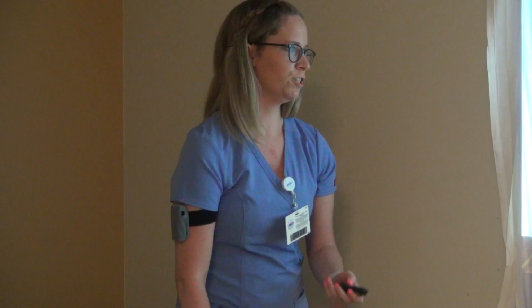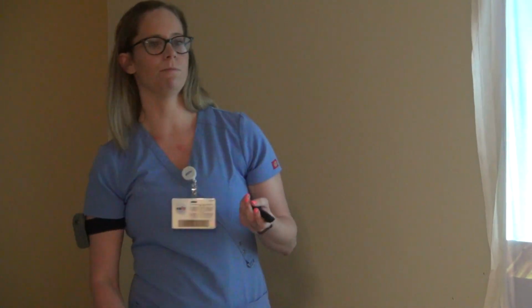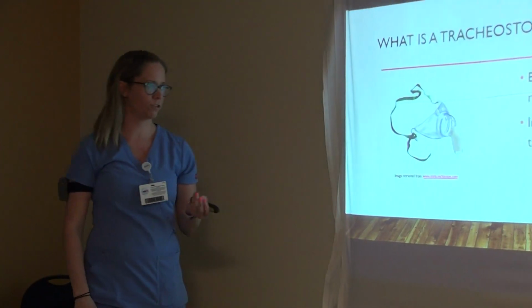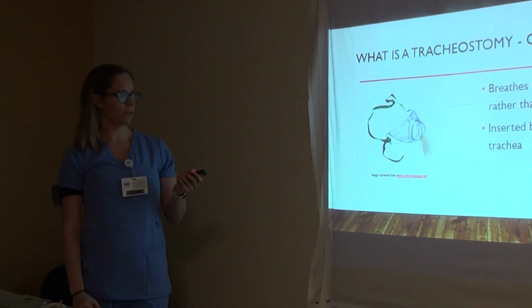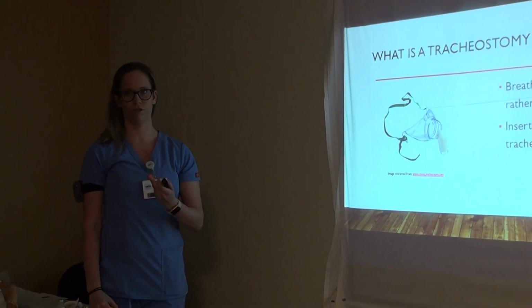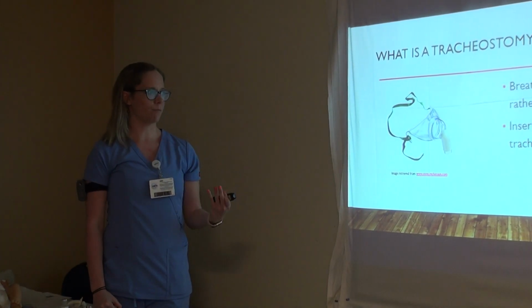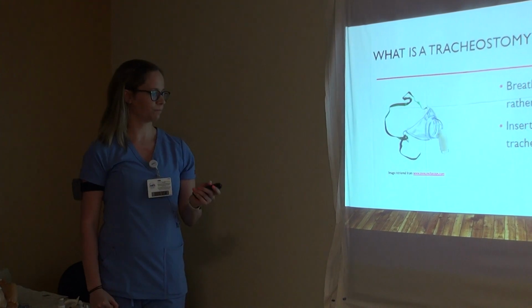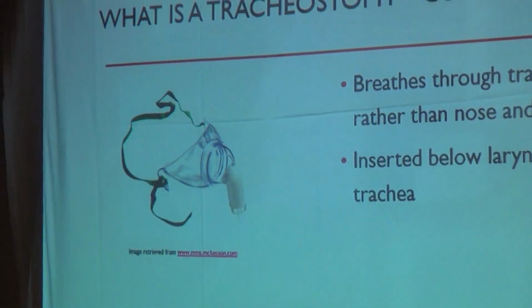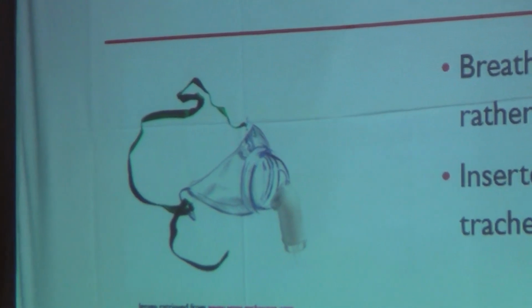This is usually initiated with speech therapy since it is a different way for them to be breathing. I had one patient one time tell me it was like breathing in and out through a straw, so they have to work up stamina with it. Passy-Muir valves don't have humidification, so their secretions can be thicker. They can get more secretions if they're on them for a while.